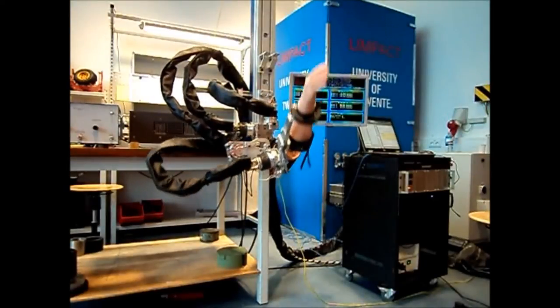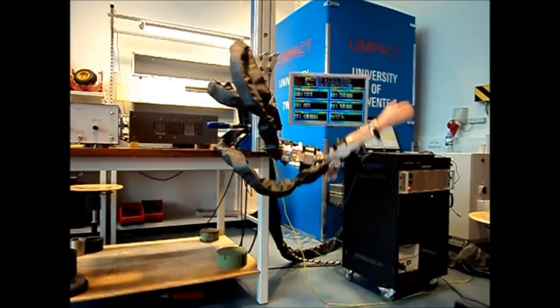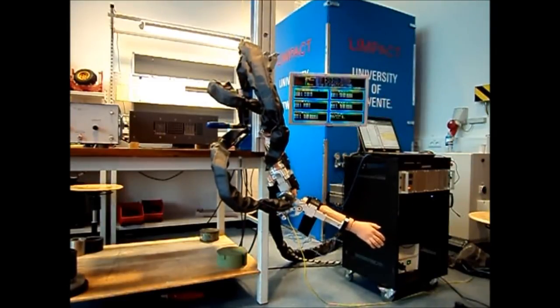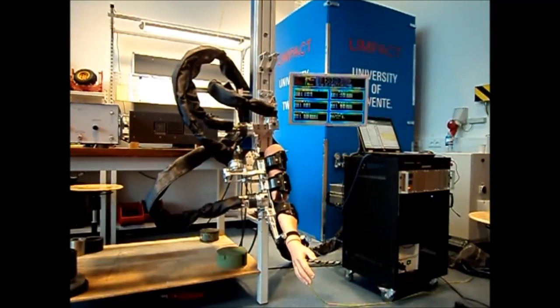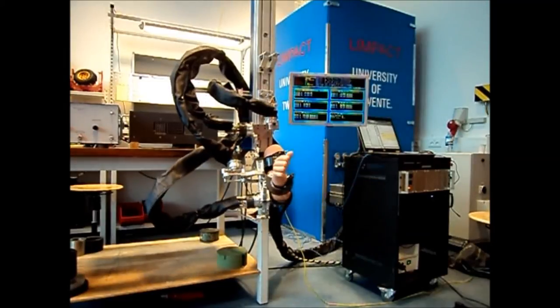The experiment was repeated using the same controller, but now with the arm of a rescue dummy attached to the LIMPACT. The added inertia causes extra overshoot and longer settling times, but it does not destabilize the system.